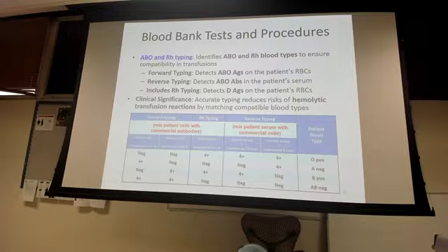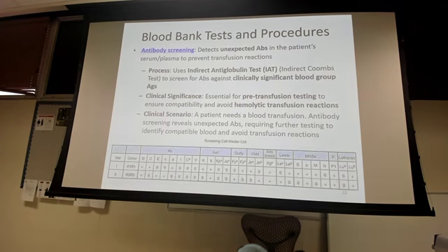So on your test, I will provide you with a forward type result, and then I would want you to tell me what the reverse typing will look like, okay? So if you got that, it's about 2 questions that I'll ask you. And if you know this chart, you'll be good to go. All right, so I'm gonna go through these quickly.